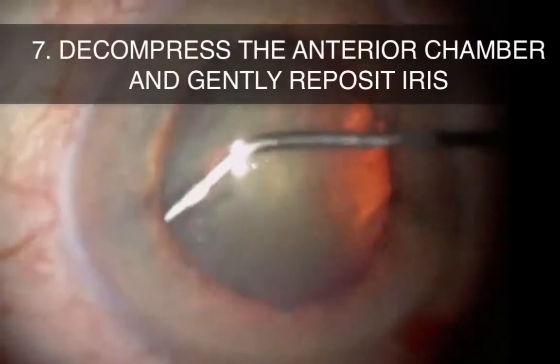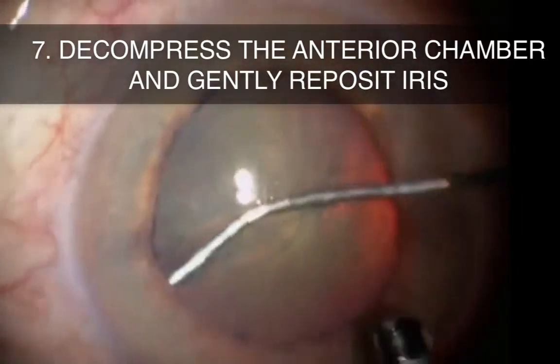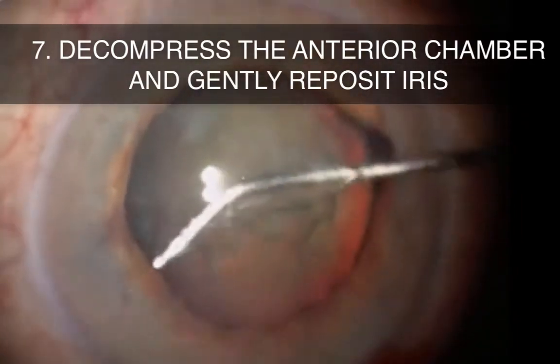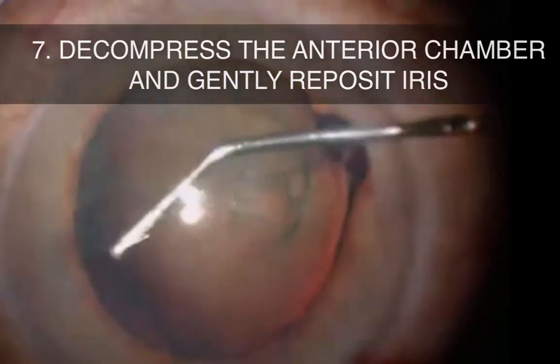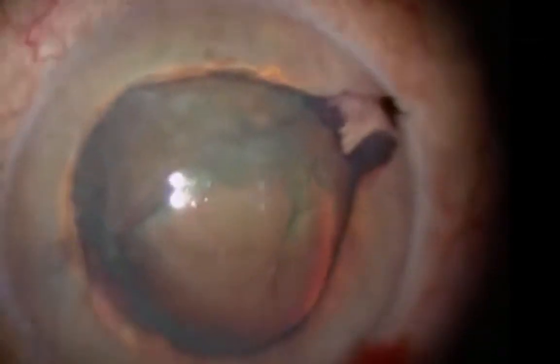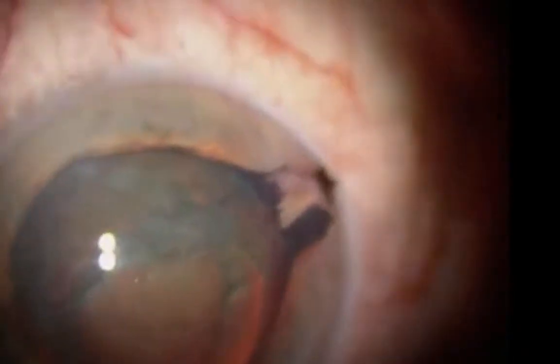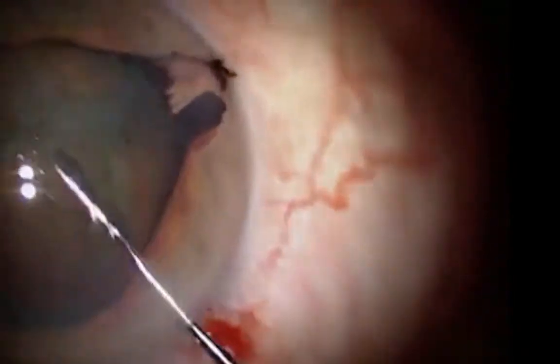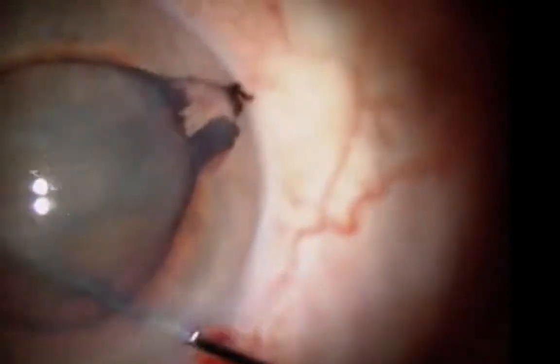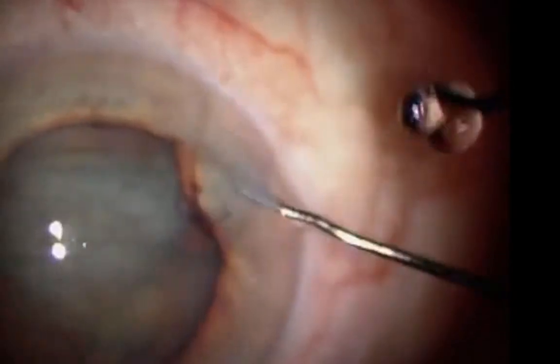Tip number seven is to once again decompress the anterior chamber, and then reposit the iris. Here we show a case of iris and lens prolapse during hydrodissection. The surgeon does a nice job to resist the urge to reposit the iris immediately, and recognizes the fluid trapped behind the lens, going in with a Drysdale to gently rock the lens, releasing the trapped fluid. The iris can then be reposited.